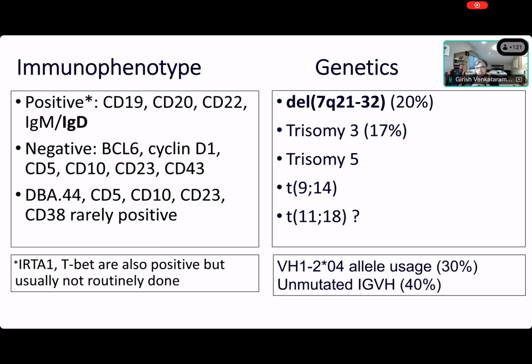So you have to know that plasma cells are famous for absorbing random things. You never believe the plasma cell staining if you don't have to, right? So remember histiocytes, MAP kinase, cyclin D1, right? That's why anything with a BRAF mutation usually also shows some cyclin D1. For example, hairy cell leukemia will also be cyclin D1 IHC positive.